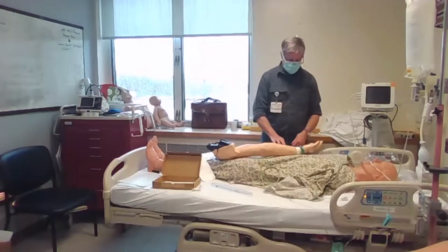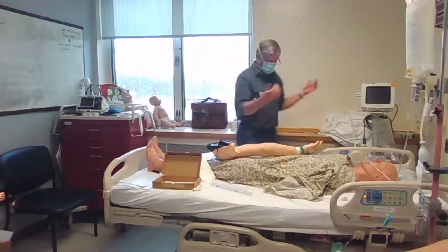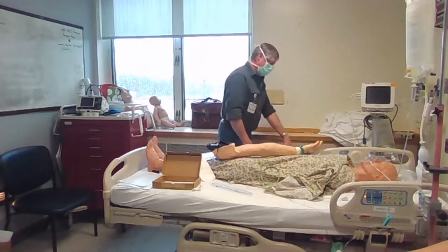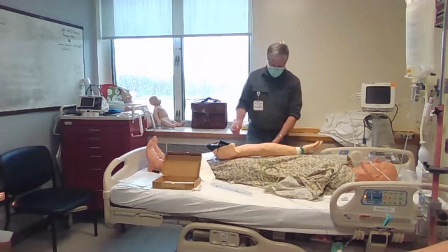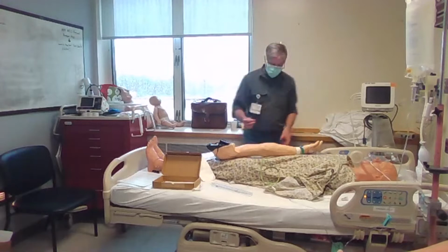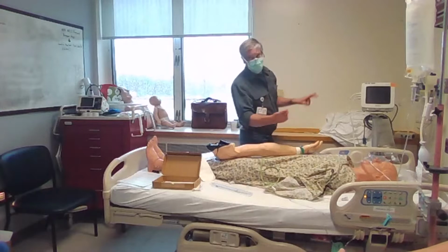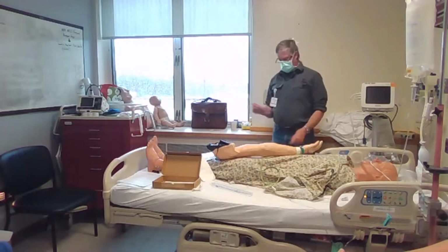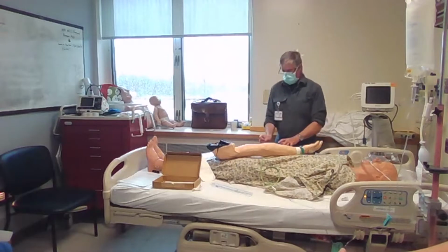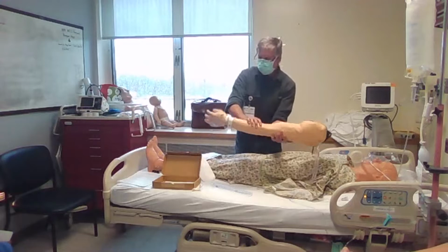So a nice way to do an A-line is to put yourself on the side of the body that benefits you, right? So if I'm going to do an A-line on this side of the body, then I want to be able to go in this direction instead of going in this direction, so that you're not going against your natural way of moving, right? If you write with your right hand, you're going to do stuff with your right hand, and it's easiest for your body to do it this way. Well, on this arm, it's easiest to do it from the other direction. Does any of that make sense?